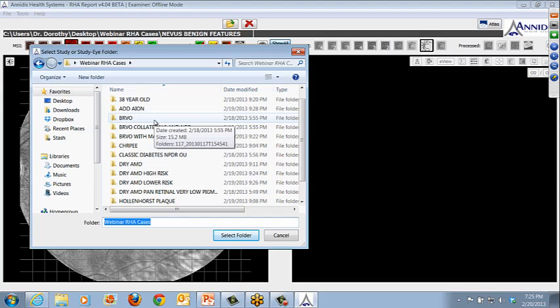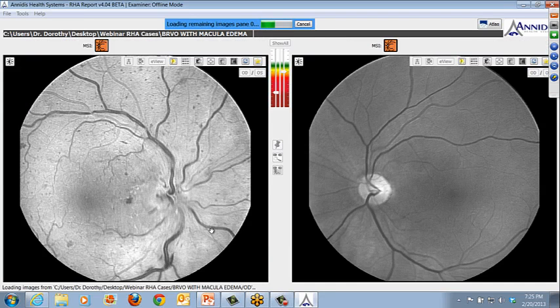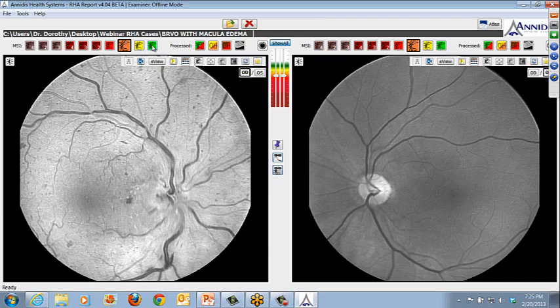And I think there were a lot of questions about changes in the vasculature that I had annotated in the patients of interest interpretation. So I don't have one right here, but let me pull up this BRVO and let's talk. I can use this as a generalized example to jog my memory here about some of the vascular features that you want to look for.